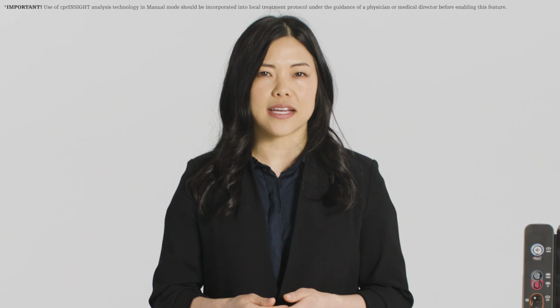Your LIFEPAK 35 may be configured with CPR Insight available in manual mode. When CPR Insight is enabled and a shockable rhythm is detected during CPR, CPR Insight enables the LIFEPAK 35 to accurately analyze the patient's heart rhythm during ongoing chest compressions. CPR Insight analysis technology enables the defibrillator to analyze the patient's heart rhythm while CPR is being performed. This can reduce pauses in chest compressions, thereby reducing interruptions in circulation of the blood.